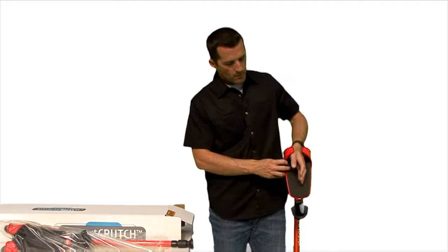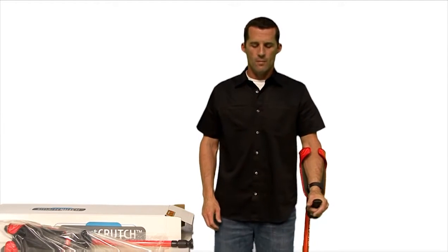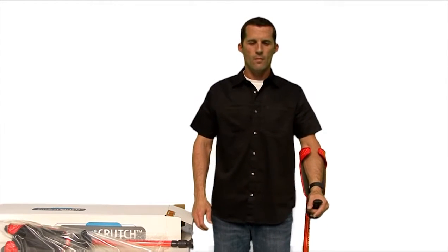Slide your hand through the cuff and place your hand on the grip. Continue to make adjustments to the height until you find a position where your shoulder is in a neutral, comfortable position.